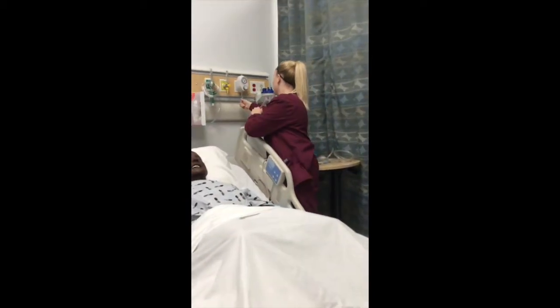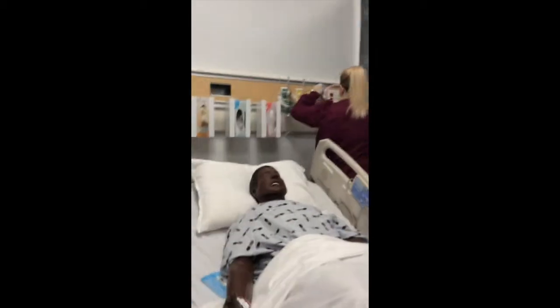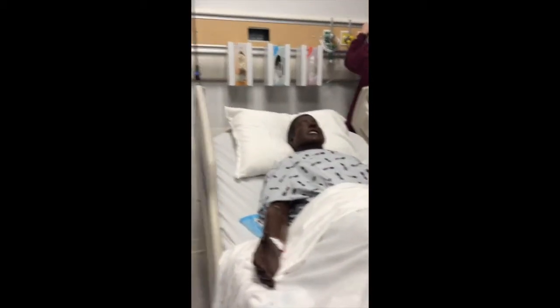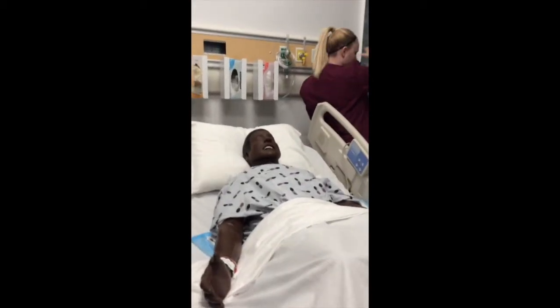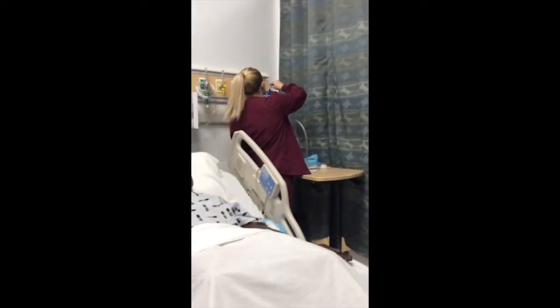I'm going to go ahead and put this on, make sure it's suctioning. I'm going to go ahead and connect this. Make sure it's suctioning. And I'm going to go ahead and connect this tube and make sure it's suctioning as well.